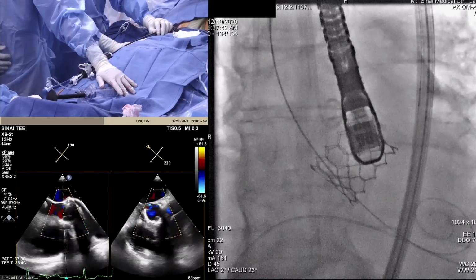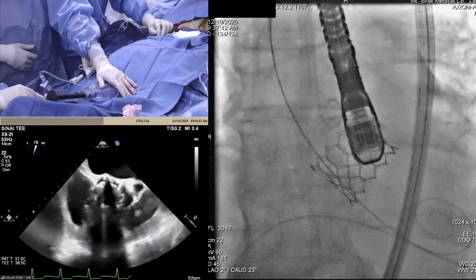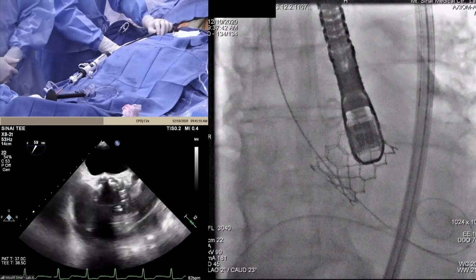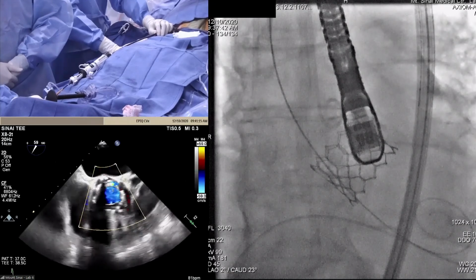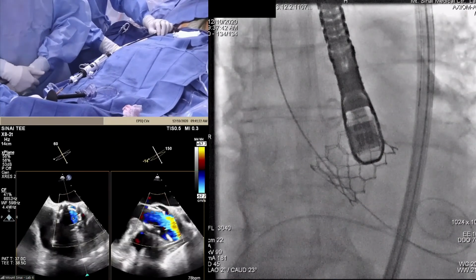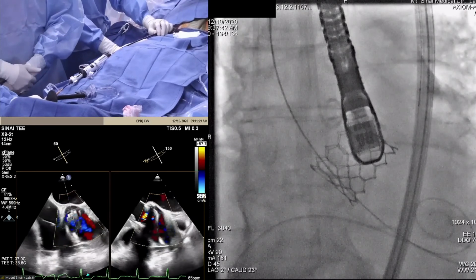And in this particular case, what does the panel think, knowing that PVL, a young guy, and he's supposed to have good prognosis of his CLL. So we will try to maximize. They put an additional 2 cc's before. They can put additional 1 or 2 cc's. We knew that annulus was very large. So not unusual, add 2 more cc's while balloon of the valve is still there, and go back with additional 2 cc's because it's still mild plus. It's a mild minus or mild plus. So this seems to be mild plus by our echocardiographic team.